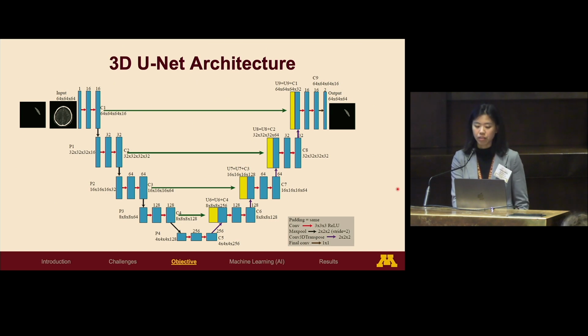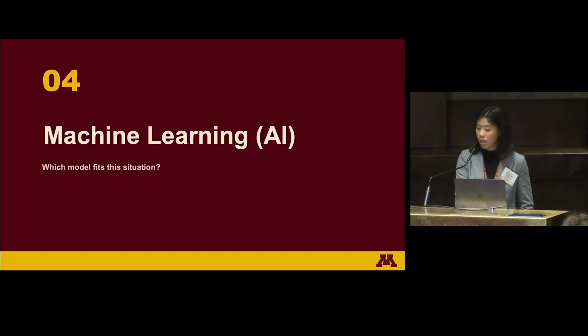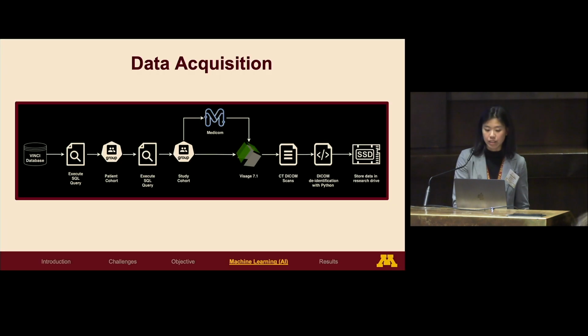In the context of chronic subdural hematoma, this structure enables us to detect and segment the hematoma with high precision, even when it presents with irregular shapes or densities. The 3D UNet effectively balances the need for both fine details and contextual information, making it ideal for automated volumetric segmentation in clinical application. So let's dive into how we implement the 3D UNet for our data set.